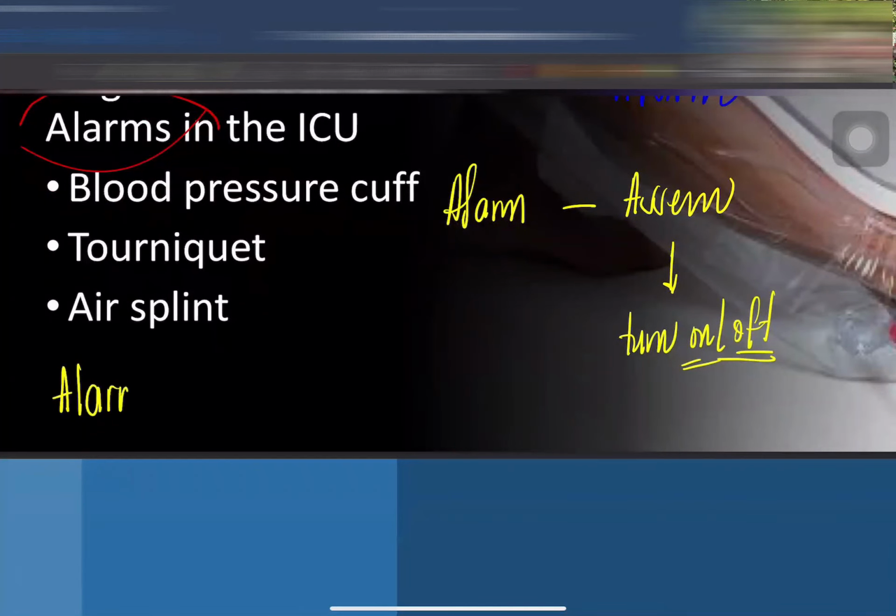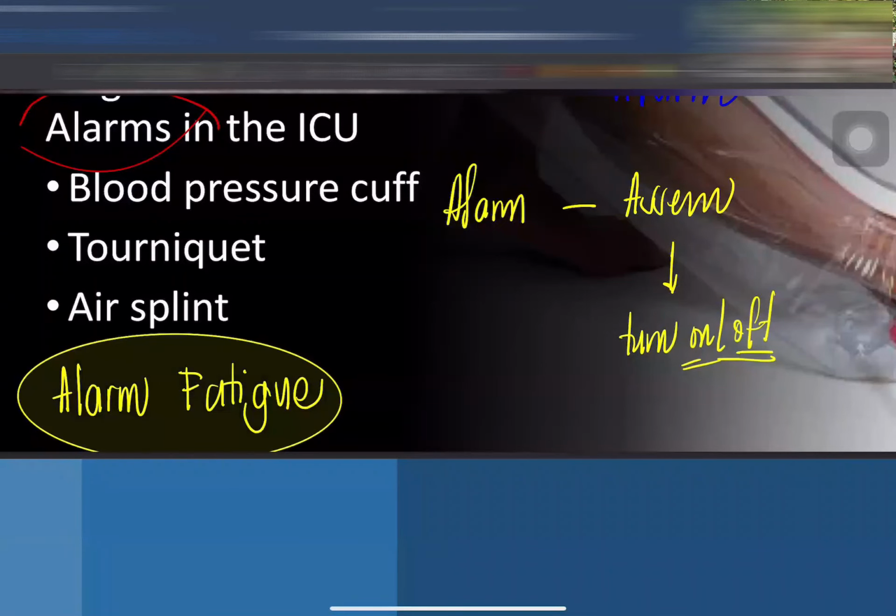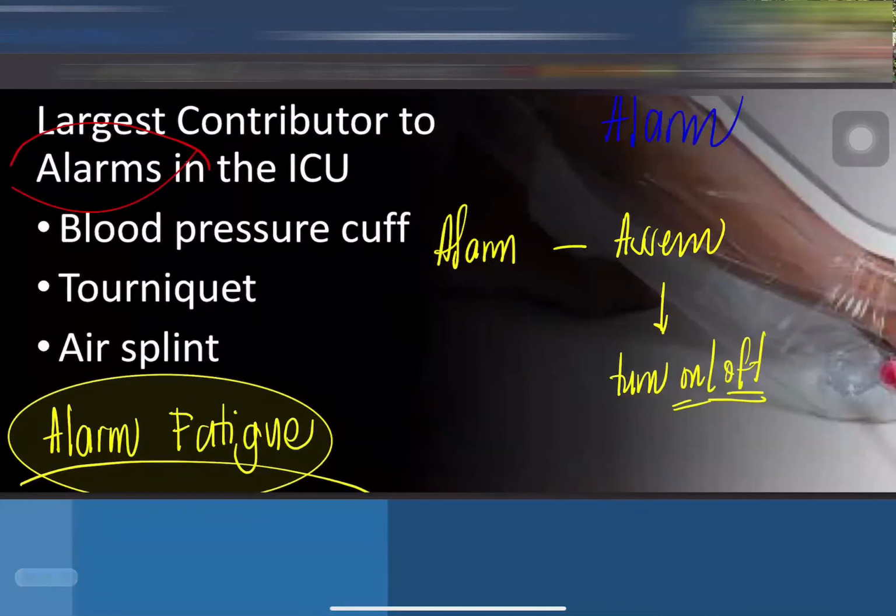Class, in the ICU, the intensive care unit, we have what we refer to as alarm fatigue. What is alarm fatigue? Think of it this way: you are the patient trying to sleep, then suddenly, beep! And you, the nurse, are trying to focus on your work, and then suddenly there's another alarm. So the concept of alarm fatigue came into the picture. My example is just one sound each, but in reality, if you have 10 patients in the ICU, often 3 alarms sound at the same time. That's why the concept of alarm fatigue arose. There are now researchers that deal with alarm fatigue.